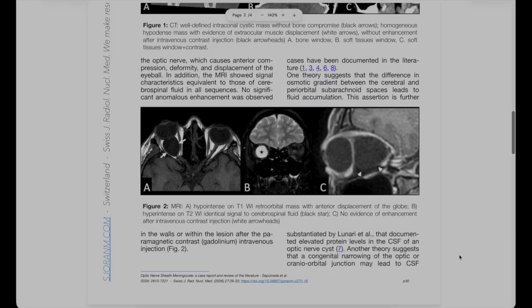ONSM does not present with characteristic symptoms. However, blurred vision, headache, retrobulbar pressure, and retroorbital pain are common symptoms. Typically, an MRI scan of the orbits is used to diagnose the condition, as it allows for visualization of a dilated optic nerve sheath filled with CSF. Some T2 weighted coronal images show a bull's eye appearance, representing the expanded CSF spaces around the optic nerve.